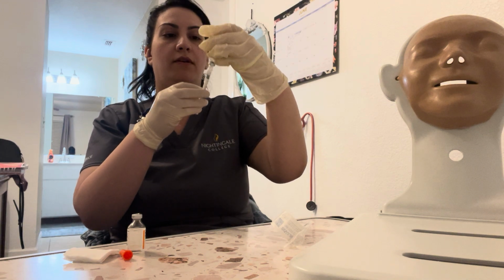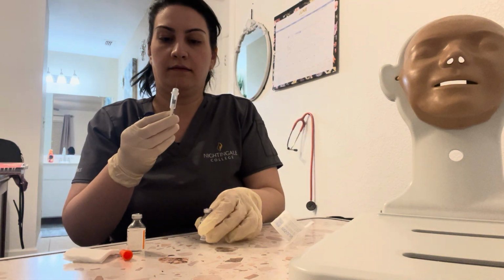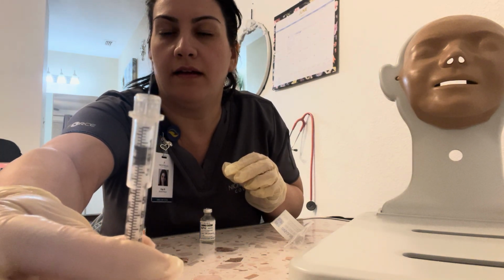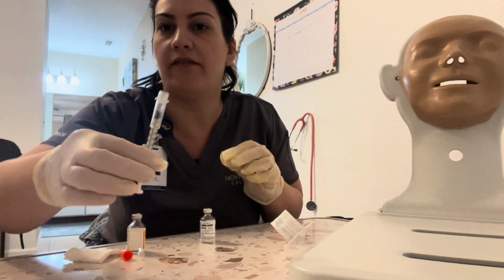Tap for any bubbles. 8 units of NPH equalizing 12 units. Nurse and I verify against the MAR.